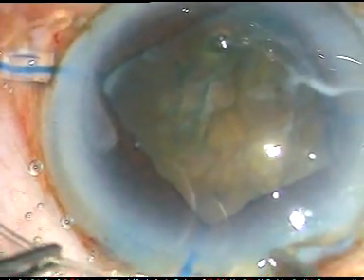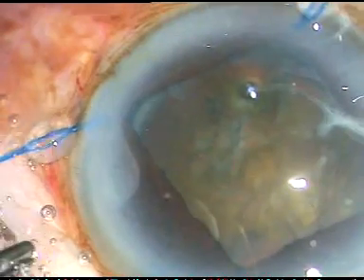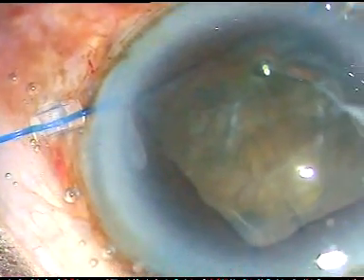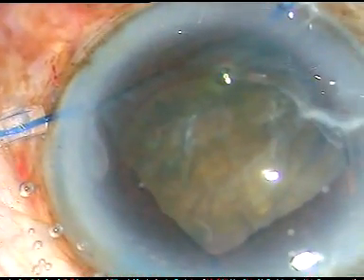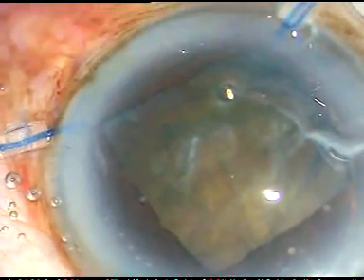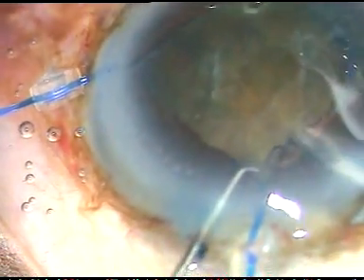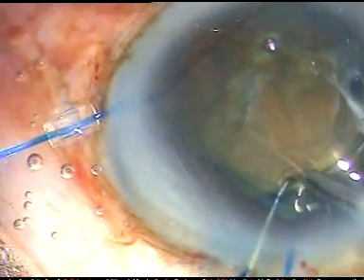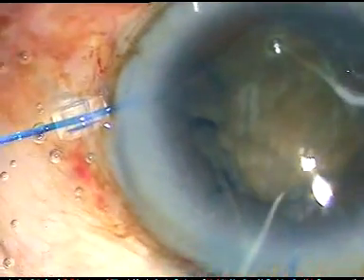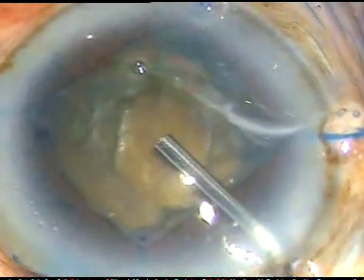The leading haptic goes underneath the capsular margin and I am gradually pushing the CTR. As I come near the trailing end, I take a McPherson's forceps, hold very near to the eyelet, go into the anterior chamber. I take a Sinskey hook in my left hand, and the prong of the Sinskey hook goes into the eyelet of the trailing end. When I am very sure, I go underneath the rhexis margin and release the CTR. Thus the CTR takes its position at the equator of the capsular bag. I am very much relieved that the bag is nicely supported.